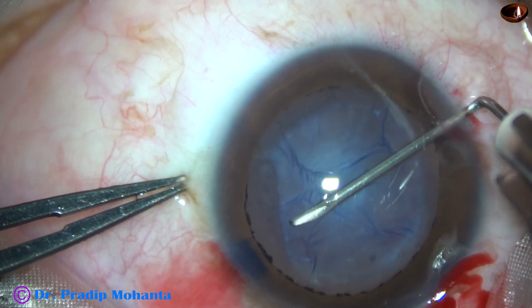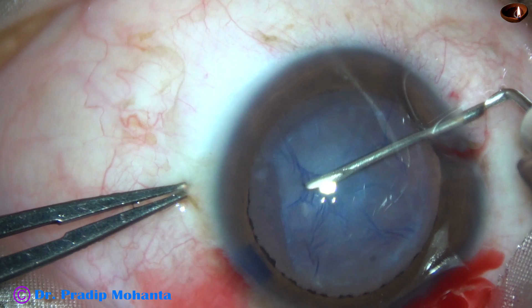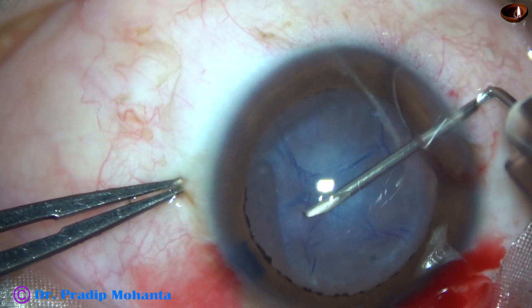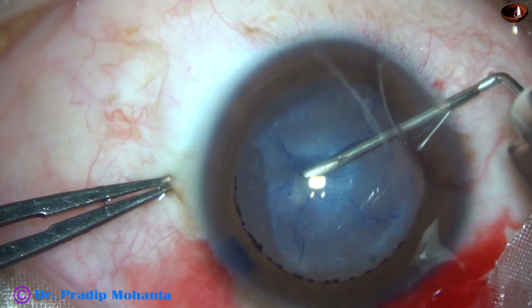So I am just trying to separate the capsule from the fibrous tissue.